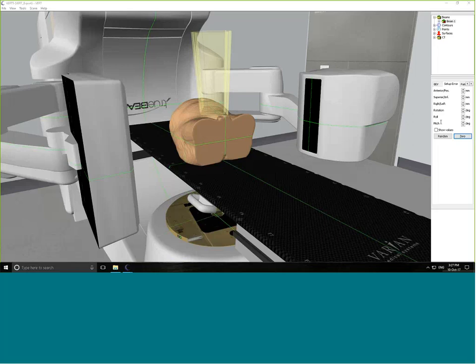Can we match the CBCT scans taken throughout treatment to the scan taken on the VERT system? Yeah, my colleague Jan's just answered that. So that's the question about being able to import your own CBCT data sets. Currently, it's not possible. We are working on that, and we are going to make some slight changes to it.